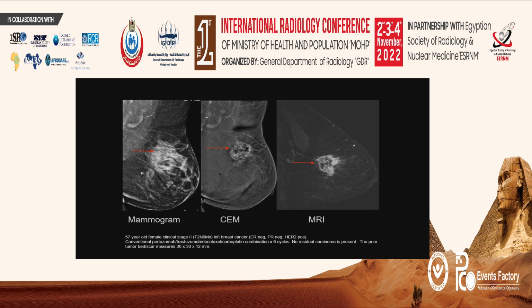Here is one of the cases that was included in her paper. This is pre-neoadjuvant therapy, and on the left is the mammogram, in the center is the contrast-enhanced mammogram, and on the right is the MRI, and you can see that they're all very similar.